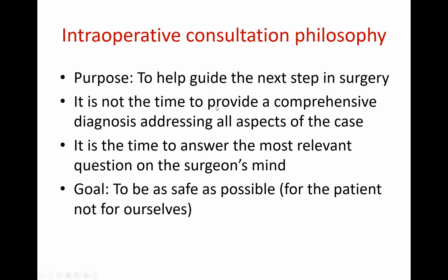So I am on a frozen section. I am not expected to come down to the specific diagnosis of the entity. If I can just answer the one question on the surgeon's mind, what to do next? That's what the surgeon is asking you. What should I do next? So I will try to focus my answer on that relevant question on the surgeon's mind. And the goal is to be as safe as possible. Of course, when we say safe as possible, I'm talking about being safe to the patient, not safe to yourself.